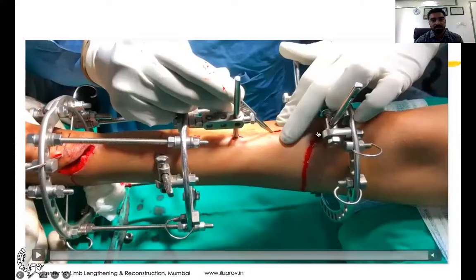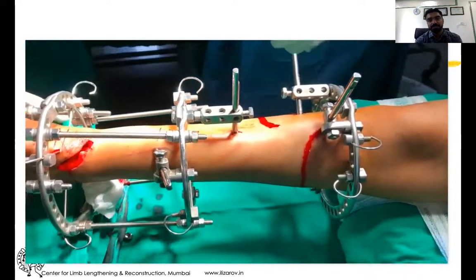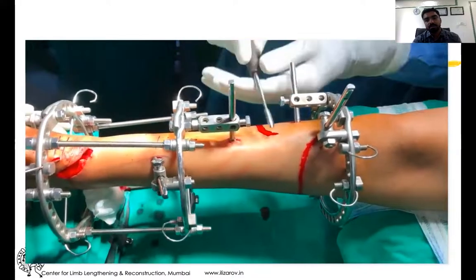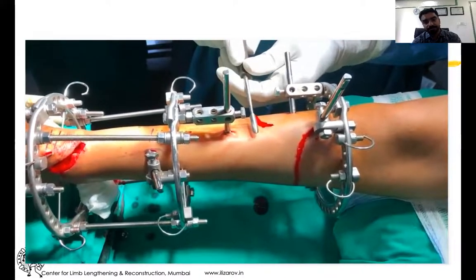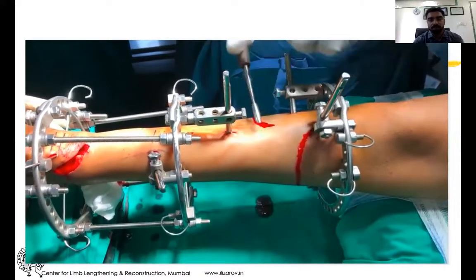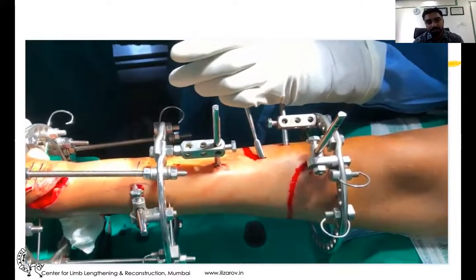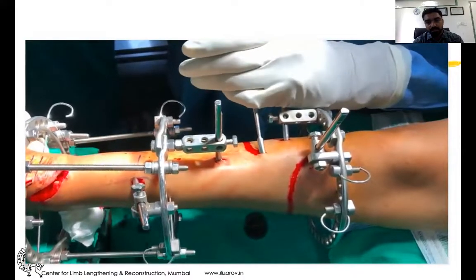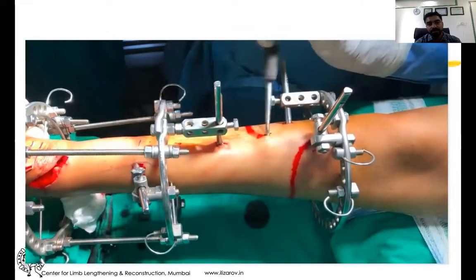Here is the video which will elaborate everything I have explained. The incision video is courtesy of Dr. Mangal sir at CLLR Mumbai. You can appreciate the 5mm periosteal elevator elevating the medial side of the periosteum.